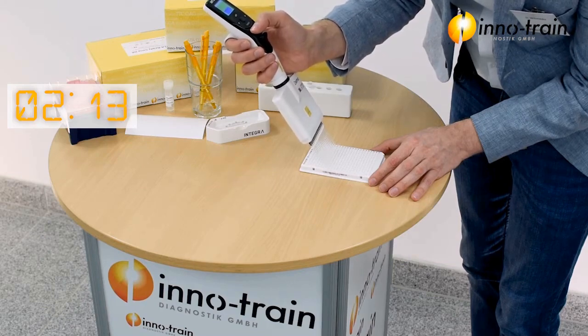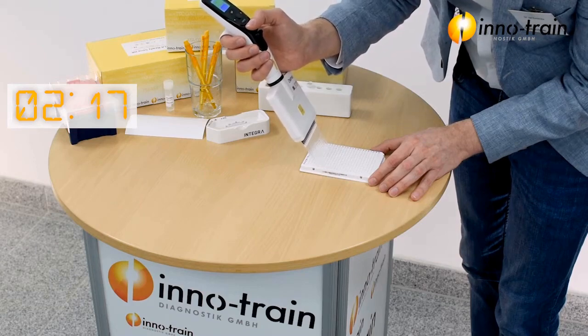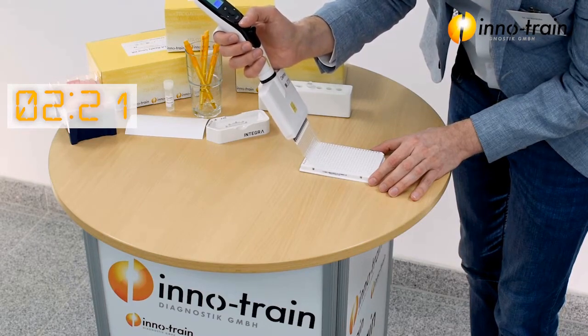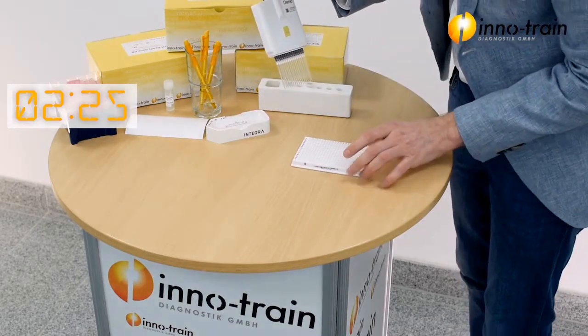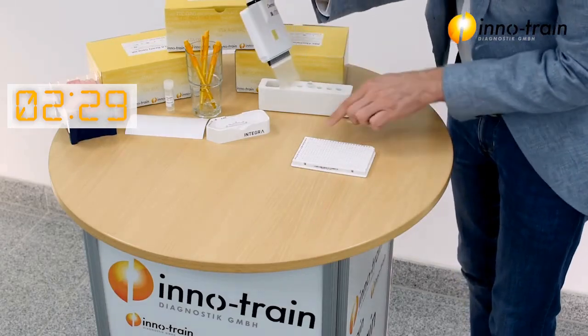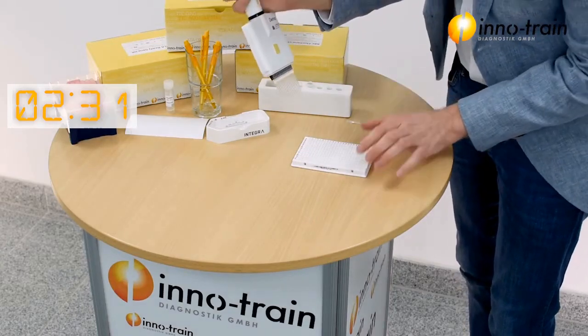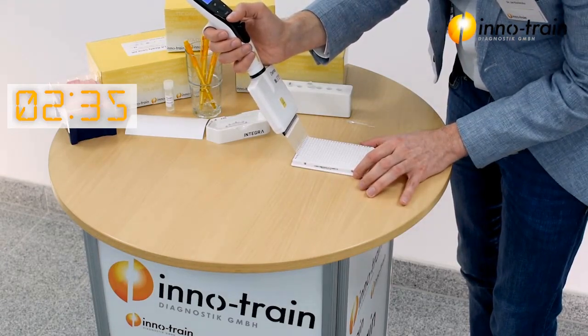You can also automate this process using Flow Assist. Just one thing you have to take care of. For the last column, remove the first tip so you don't pipette your DNA into the negative control, and pipette in the last column.